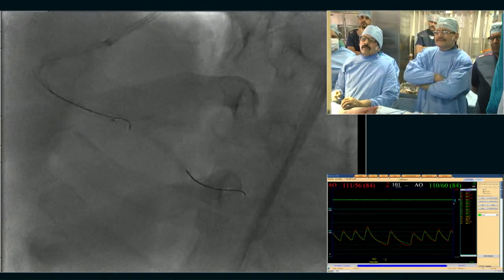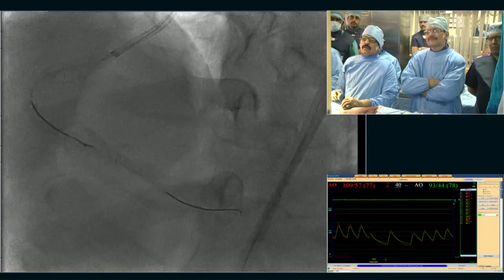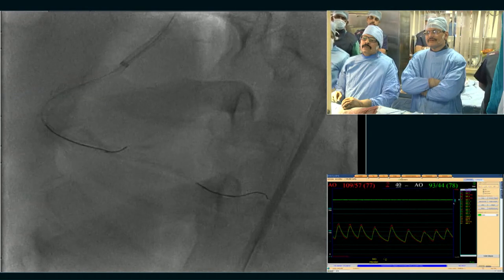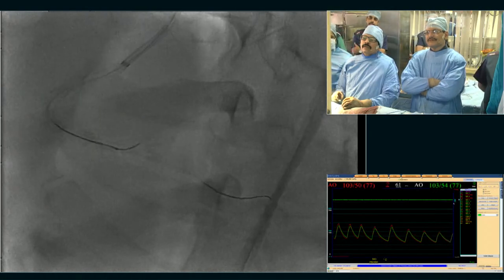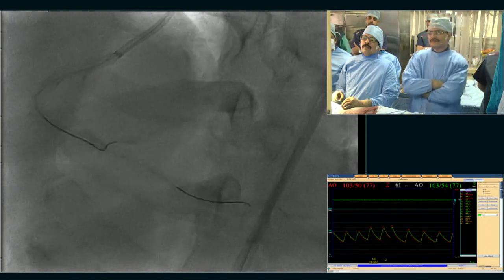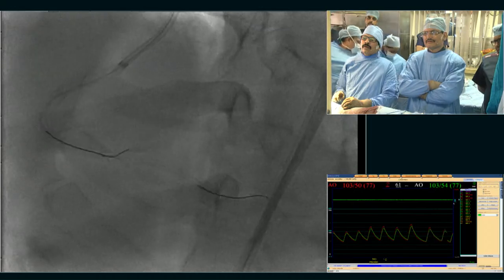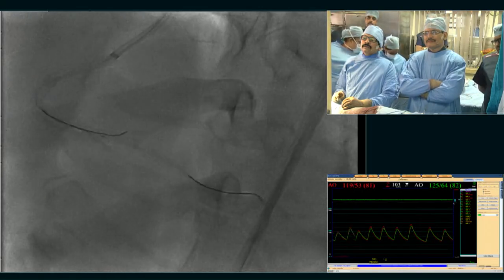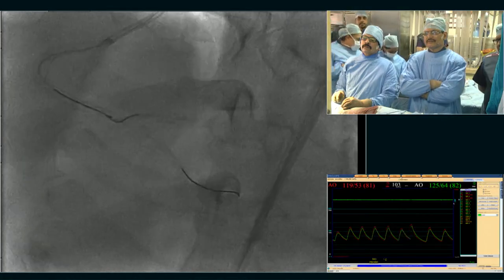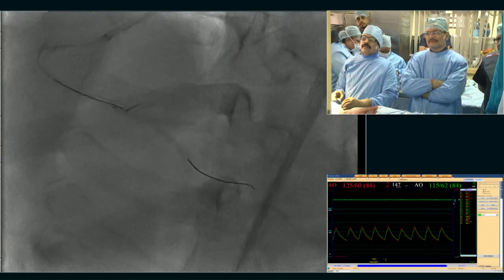Yes, I think we have a great learning case here. First of all, this is at the previous stent. It went. So we have a previous angiogram. So we should have seen that previous angiogram. Sure. So we know really how the distal looks and what was the end result before, and so we plan. So proper planning for the case is the key to success.